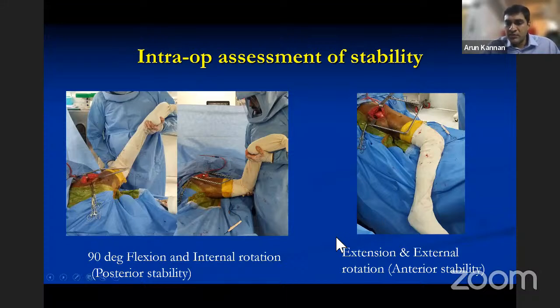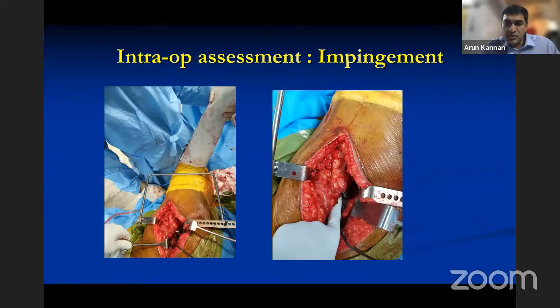So here is where I think we should differentiate between component versus bone impingement. The way I have been doing it, even before I had the software, was to put the finger against the femoral neck anteriorly and see if that is impinging against the cup.